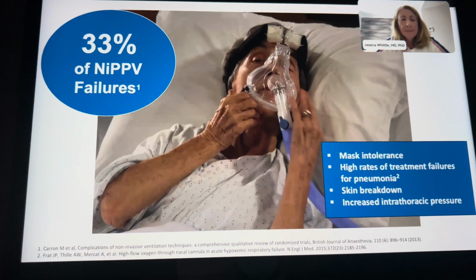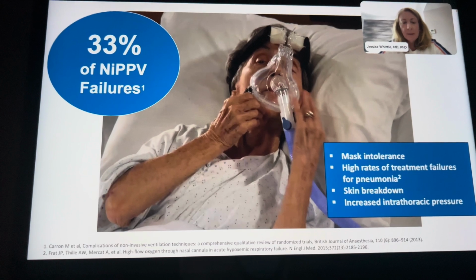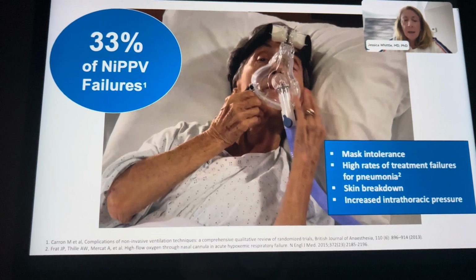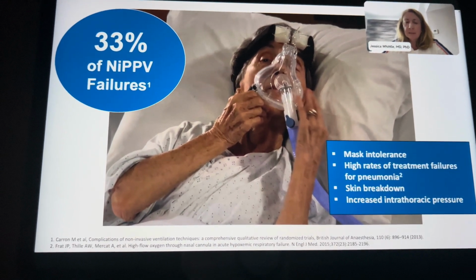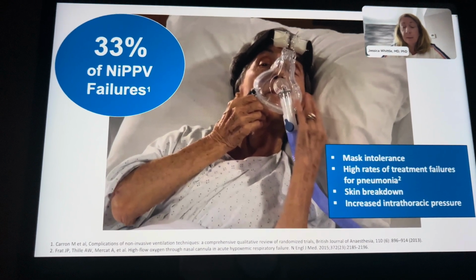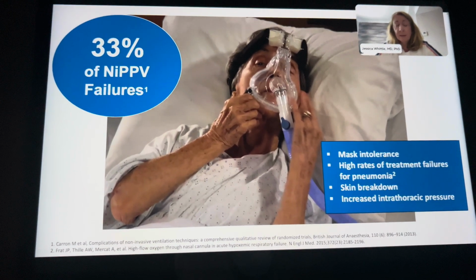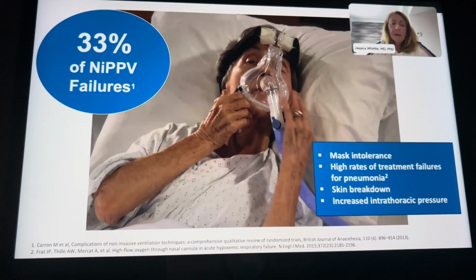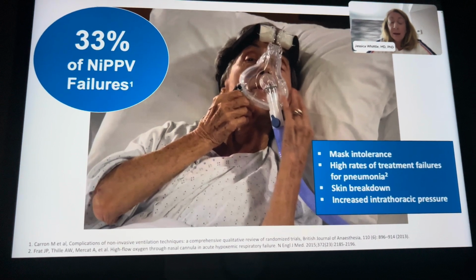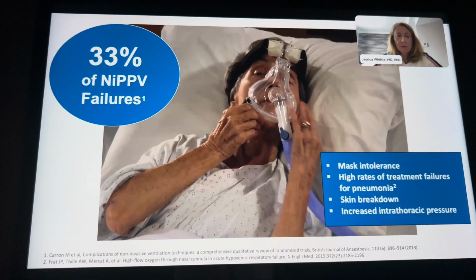We did a study in around 2015 that looked at all patients with respiratory distress, and many of you are familiar with that data. And we were able to find that there were really no differences in intubation rates or failure rates for 72 hours for patients who came to the emergency department presenting with respiratory distress when we compared treating them with velocity-based therapy versus the mask-based. But what was interesting in that data is about 1/3 of those patients were hypercapnic instead of hypoxic. So they were type 2 respiratory failures.